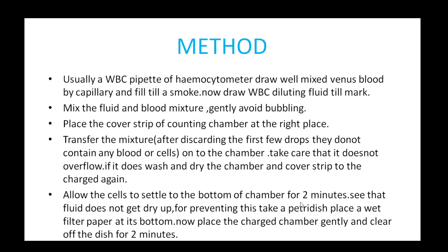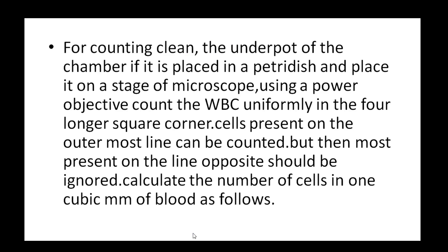We need to allow the cells to settle for 2 minutes. To prevent the chamber from drying up, place a wet filter paper in a petri dish. Place the chamber in the petri dish for 2 minutes, then carefully clean the chamber as needed. Place the chamber on the stage of the microscope.